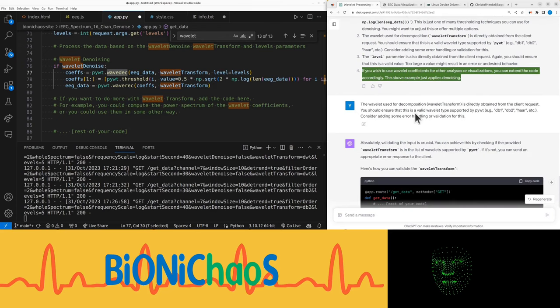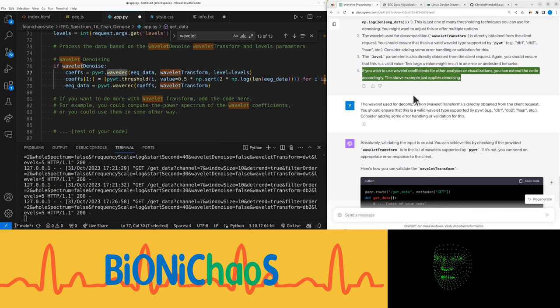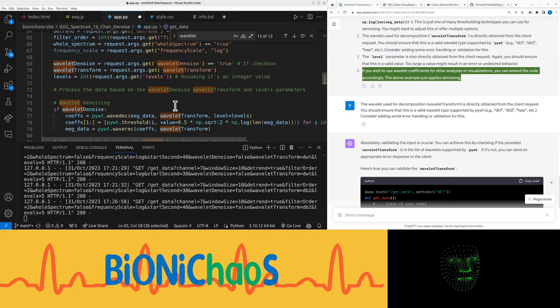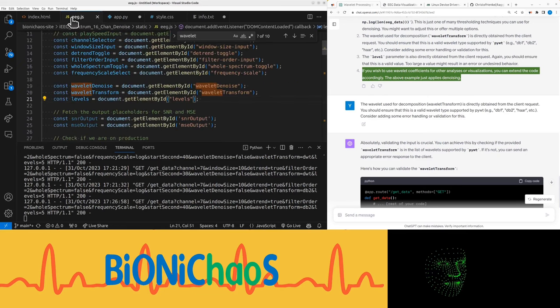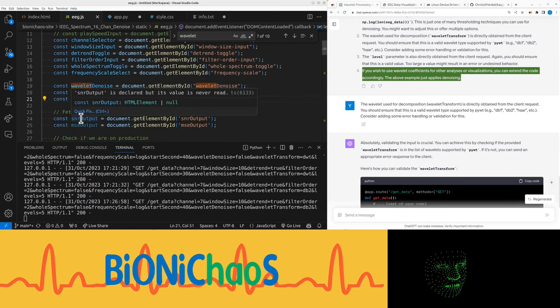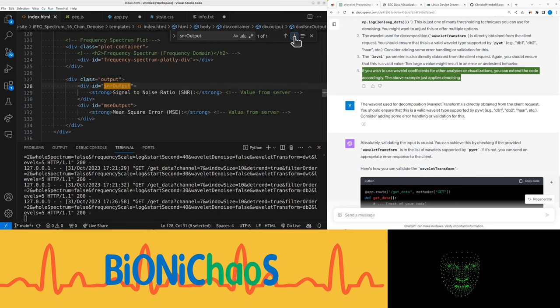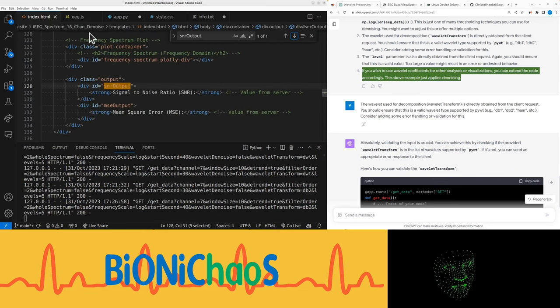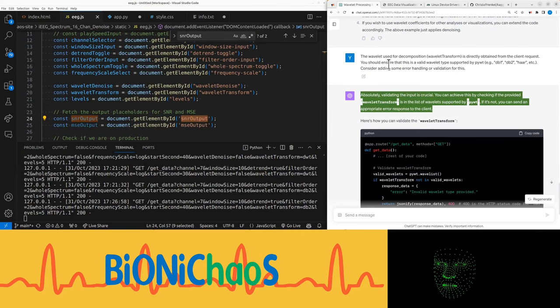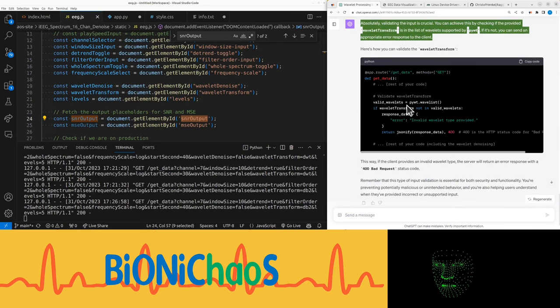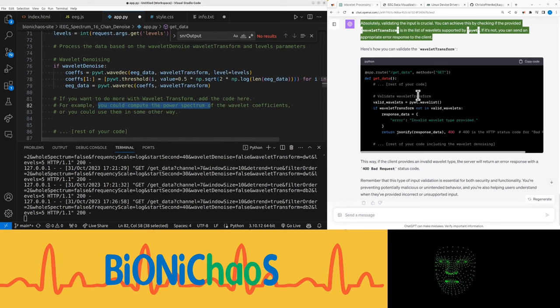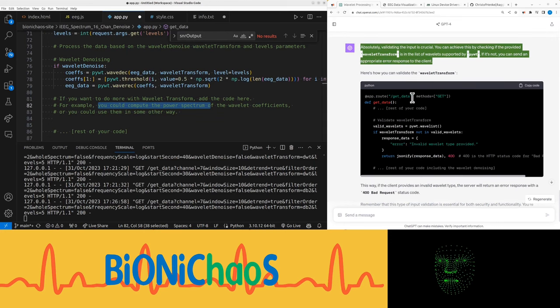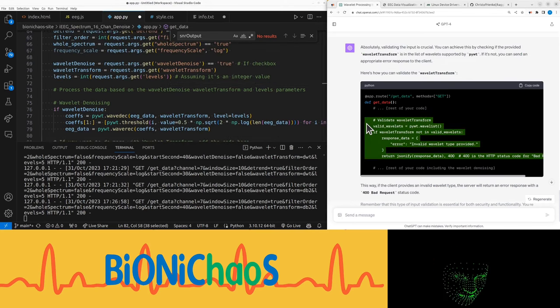If you wish to use wavelet coefficients for other analyses or visualizations, you can extend the code accordingly. The above example just applies denoising. We also have the outputs. Make sure it's the correct MID. Right, so I want to do some error checking first. Validating the input is crucial. You can achieve this by checking if the provided wavelet transform is in the list of wavelets supported by PyWT. If it's not, you can send an appropriate error response to the client.